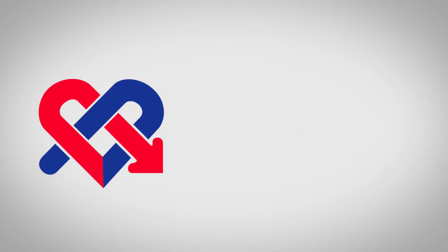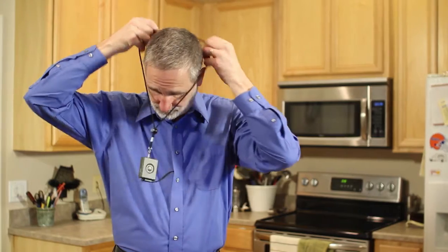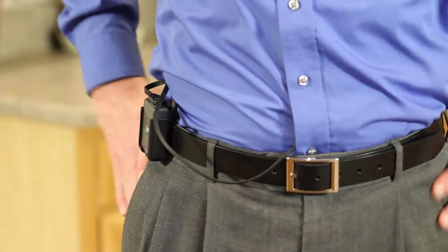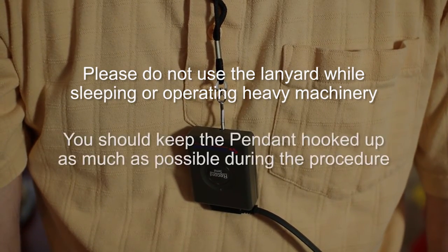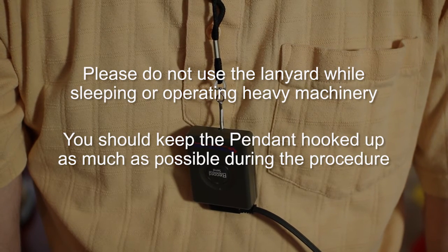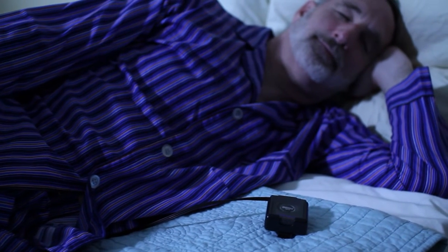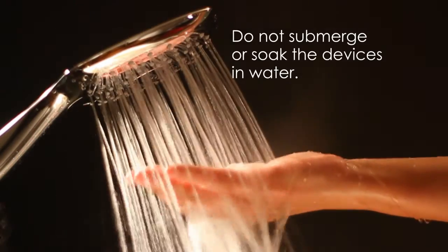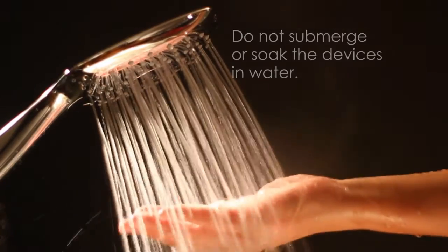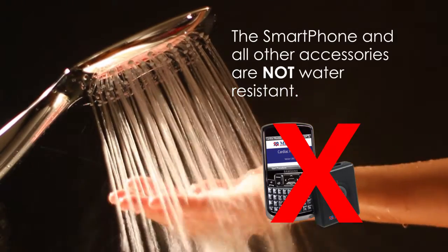Wearing the monitor. You may wear the pendant around your neck using the lanyard, or on your belt or other clothing using the belt clip. Please do not use the lanyard while sleeping or operating machinery. You should keep the pendant hooked up to you as much as possible during the length of your procedure, including when you sleep and during your regular daily activities. But always follow your doctor's instructions. Do not submerge or soak the devices in water. The handset and other accessories are not water resistant. Please take precautions to prevent the smartphone from any moisture.